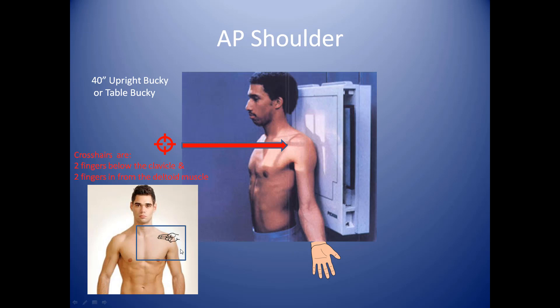As far as side to side, you're going to want to locate the deltoid muscle. The deltoid muscle is at the top of the arm and rounds off about right there. Take two fingers and measure two fingers in from the deltoid muscle. Where your two fingers intersect, shine your camera crosshairs right there and it'll be a good centering point.